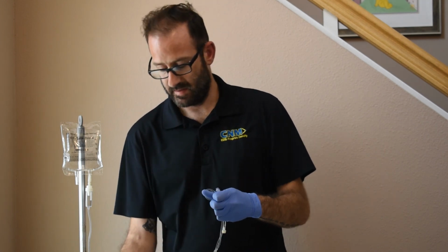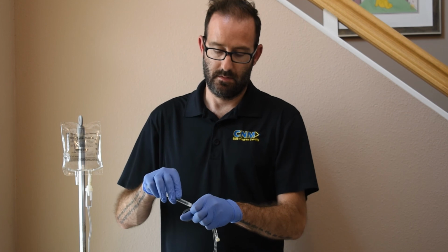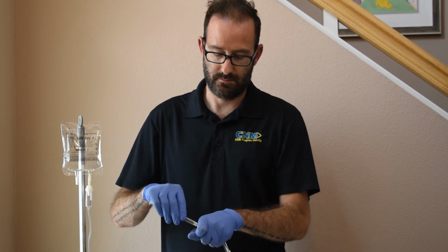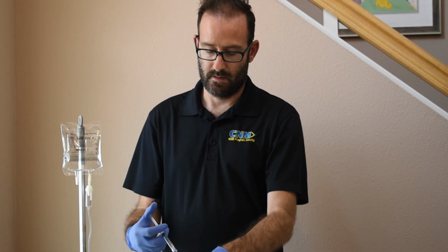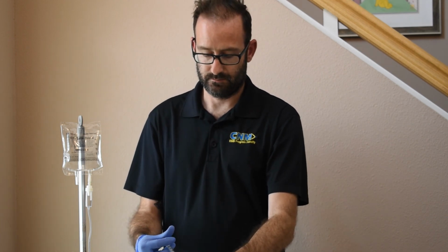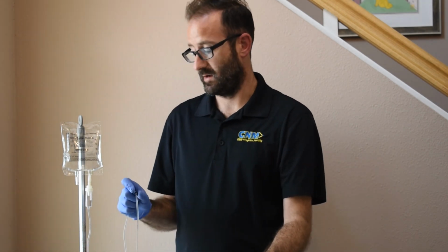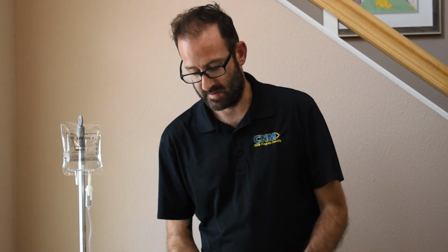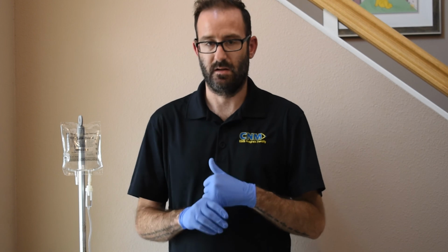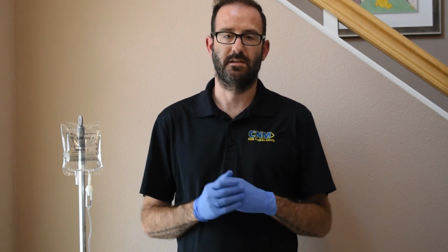After that is cleaned, I'm going to shut the flow to my IV line, attach my syringe to my needleless port, administer my medication, remove the syringe, discard my syringe, and then I'm going to go ahead and open my flow, run the line, and again I will be documenting everything that I did, as well as looking for any adverse reactions and desired effects of the medication.